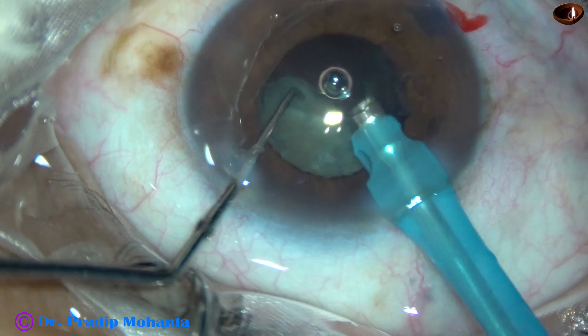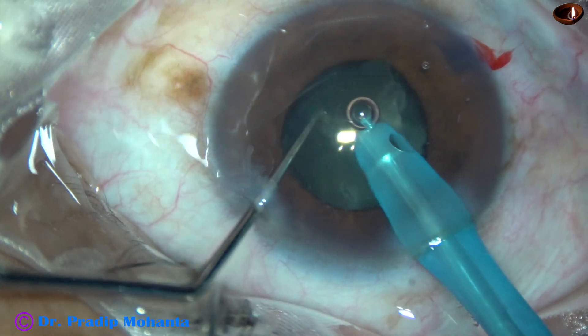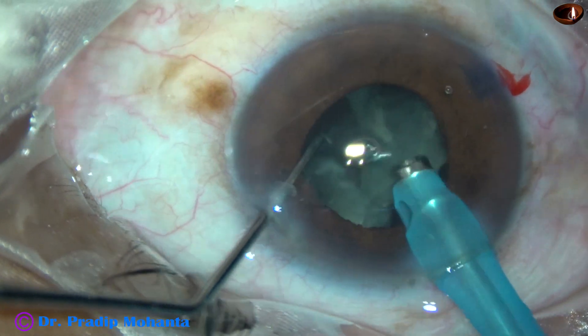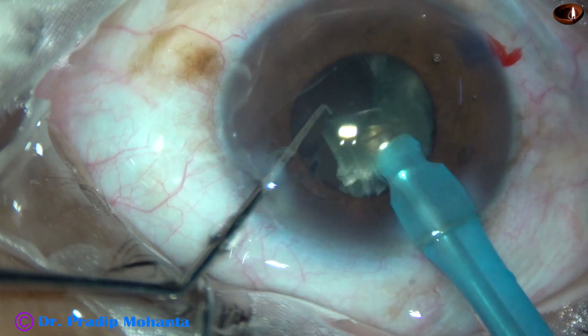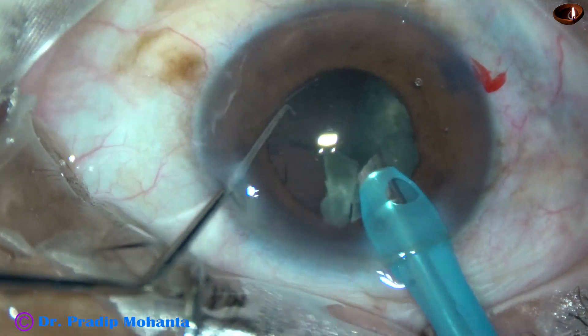In this case, ultrasonic energy used is 60%, though 60% was not used most of the time. Flow rate is 45 ml per minute and vacuum is 450 mmHg. This is Centurion Cataract phacoemulsification.